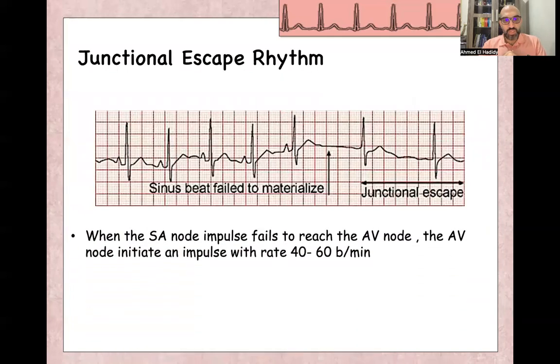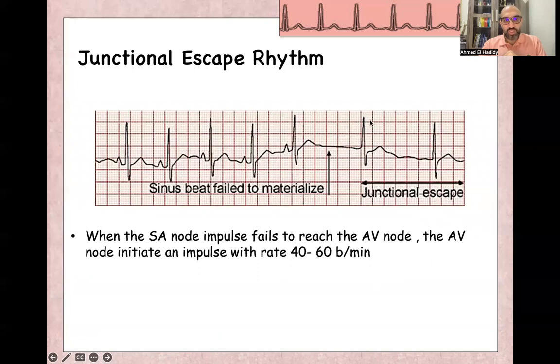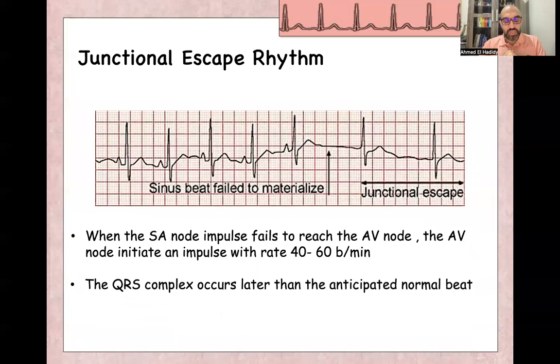Junctional escape rhythm happens when the SA node impulse itself fails to reach the AV node. So this is a normal sinus beat, normal sinus beat, and here there is a stop of sinus beat for milliseconds. So the AV node starts to take over, which is called junctional escape rhythm. It's a rate between 40 to 60 beats per minute. The QRS complex will be narrow complex and it appears later than anticipated — later than the anticipated sinus beat.